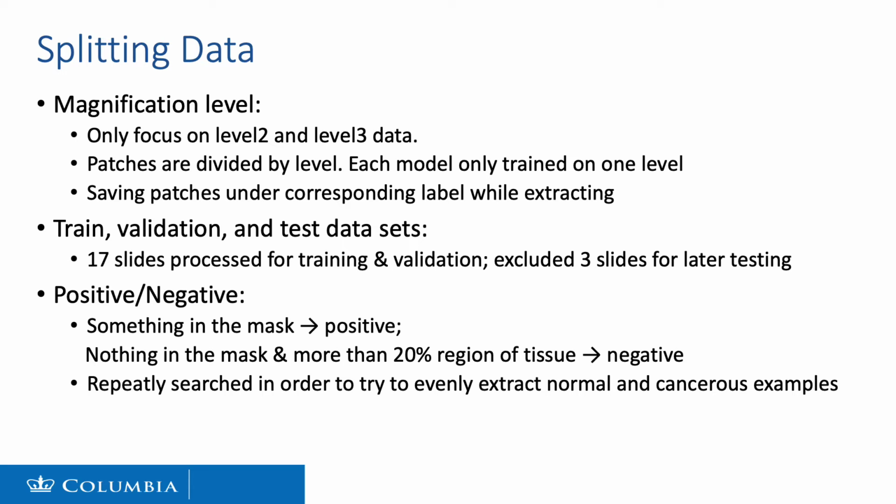So if there's nothing in the mask and there's more than 20% tissue region, we say this is a negative patch.